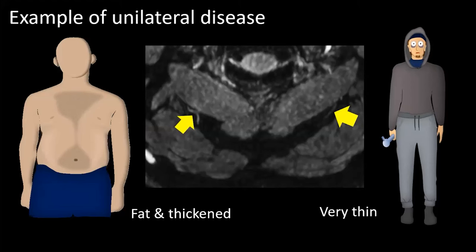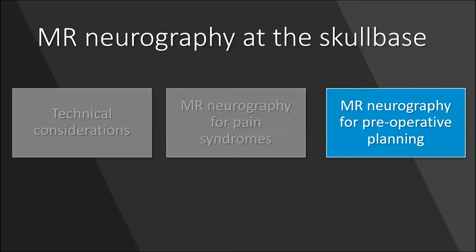to help this patient. So I'd like to end on what we're really trying to push and use this MR neurography for, which is preoperative planning for our skull-based surgeons for skull-based tumors in particular. We also want to use it for our ENT surgeons for parotid surgeries.